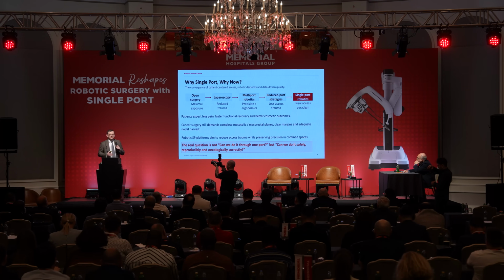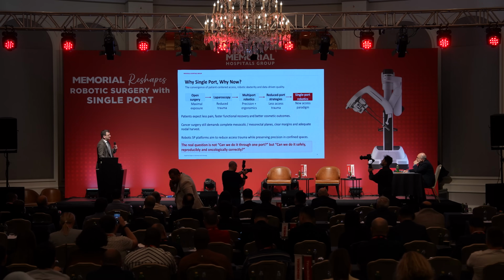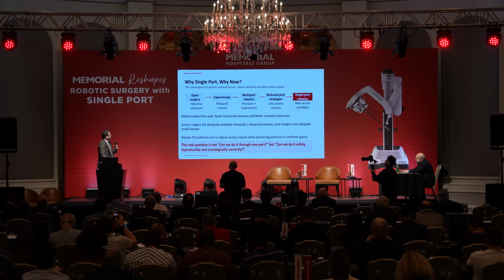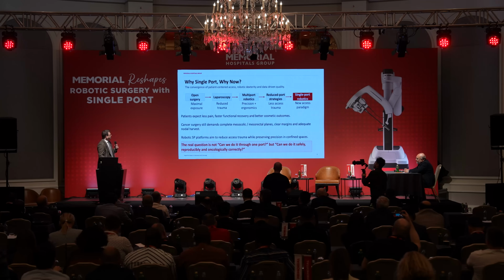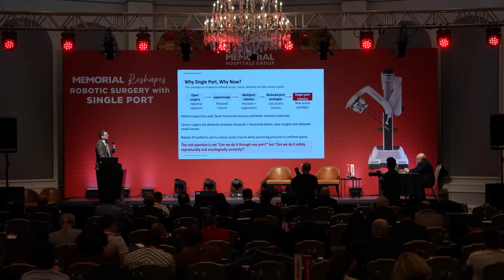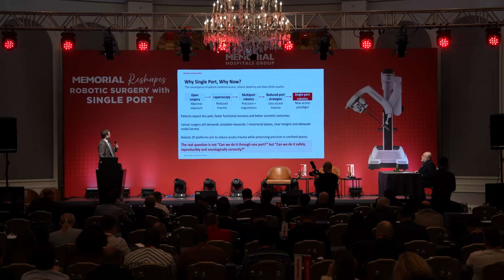Surgical techniques are in an evolution period. With the application of laparoscopic surgery, we started to struggle with the laparoscopic instruments, and robotic platforms are built to overcome these limitations. Then we noticed that we can do some of the operations with fewer port insertions, with smaller operations.